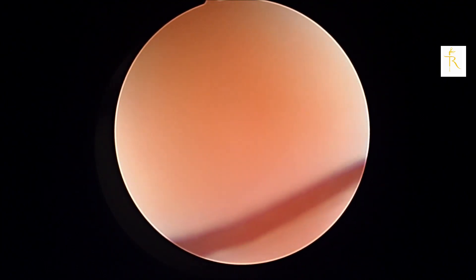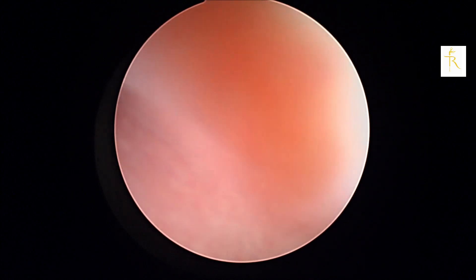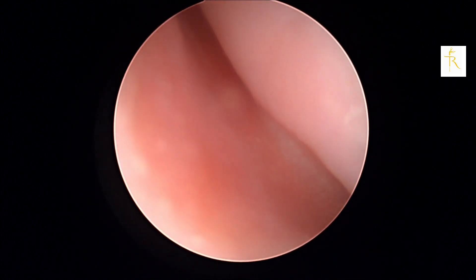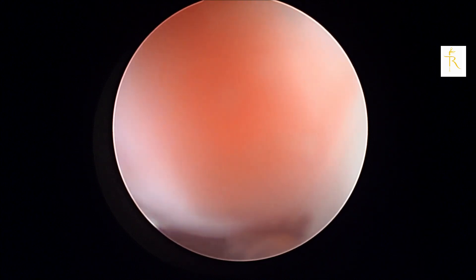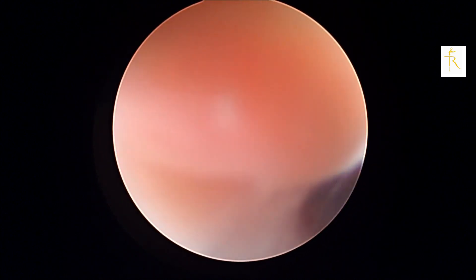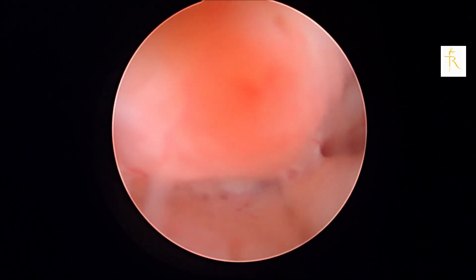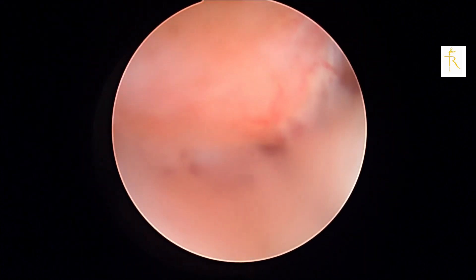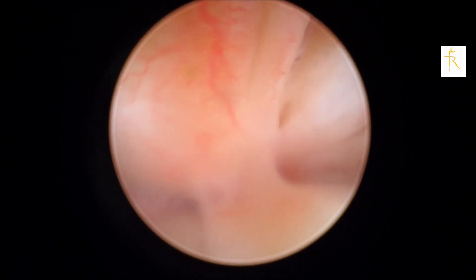As you can see, we have now put the hysteroscope in the vagina and essentially all we're doing is looking around the vagina. I go posteriorly first and have a look around, then go anteriorly to figure out where the cervix is. As you can see, we're now seeing the cervix — that's the external os — and we're trying to negotiate our way through it without using undue force or trauma.